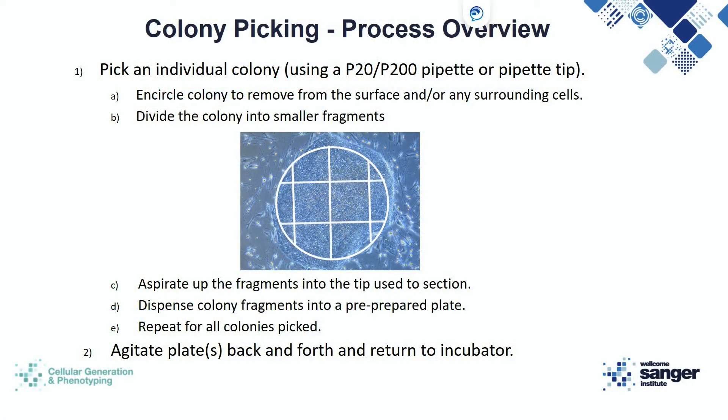We recommend using a P20 or P200 pipette when colony picking. The P20 is more suitable for those with more experience, as you want to reduce the amount of volume you're transferring over to the new plate. Those with less experience may benefit from starting out by using just the tip, though this may increase the chances of contamination as your hand is leaning over the area you're colony picking from. The first step should be to take the tip and trace around the outside of the colony. You can also use this time to clear away any partially reprogrammed or other colonies from the edge of this colony.